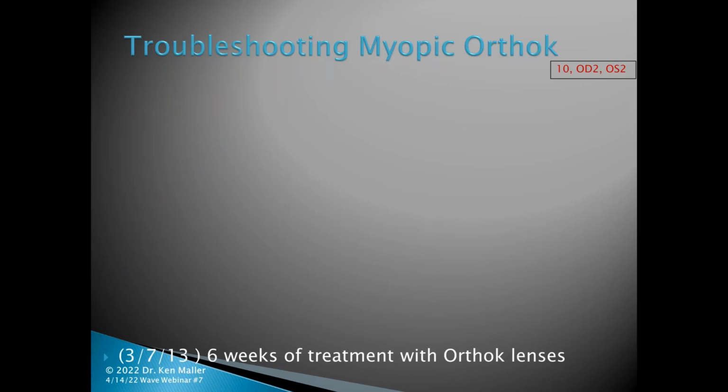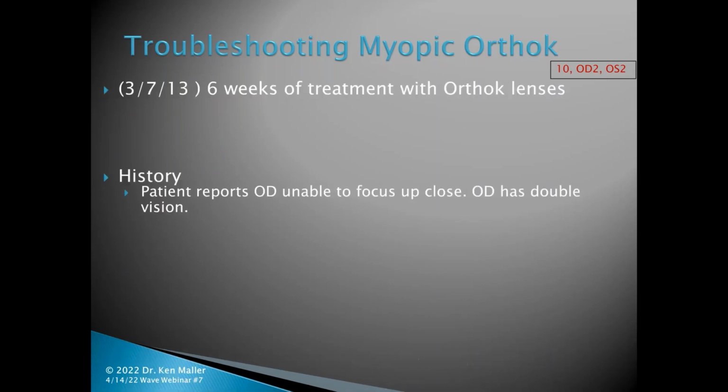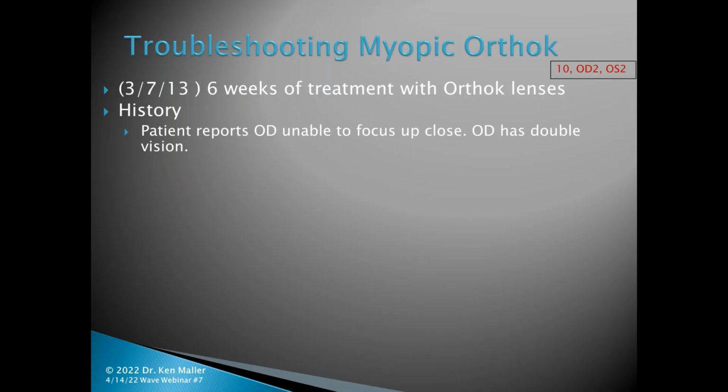His 10th visit, wearing OD number 2 and OS number 2. He's 6 weeks into treatment. He reports the right one is unable to focus up close, and the right one has double vision.